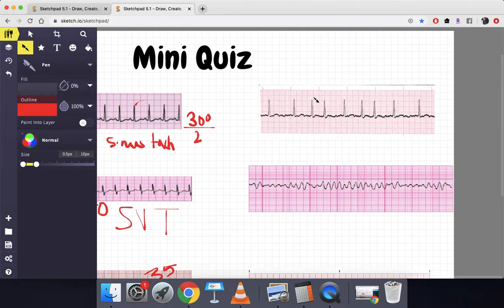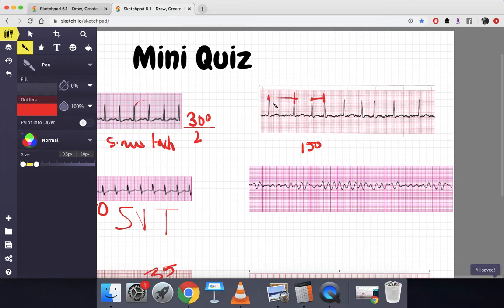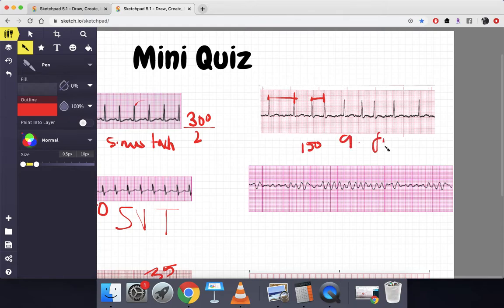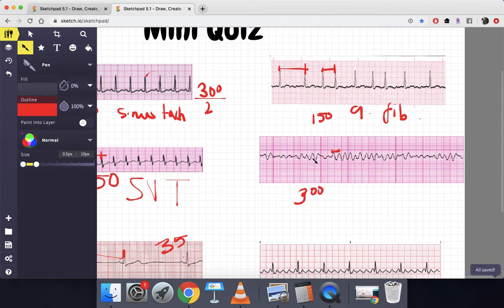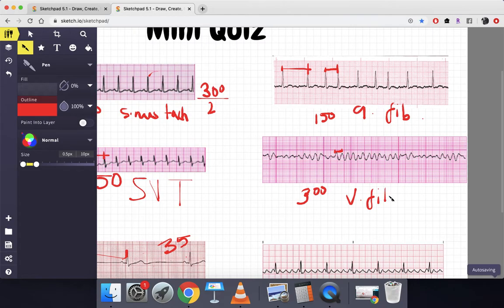Next one: the R interval gives 300 divided by 2 equals 150; however, the R intervals are different — this is definitely irregular. There are no discernible P waves. As I said, when it's irregular with no discernible P waves, this is AFib. Let's try another one: this one is less than one big box, so technically over 300 beats per minute. The QRS complexes are wider than four small boxes, and it's on a straight chaotic line — this is VFib.